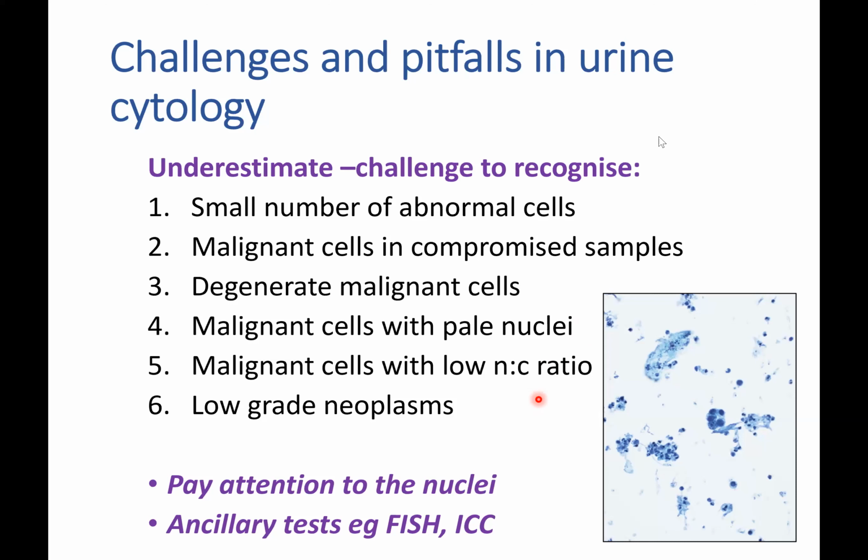When assessing cells in these situations, it's important really to pay attention to the nuclei in helping to determine whether or not they are abnormal, but sometimes you may need to resort to ancillary testing such as FISH to assess the cells.